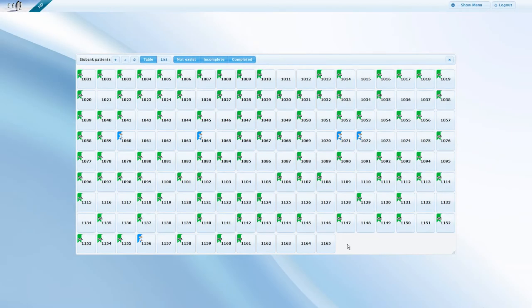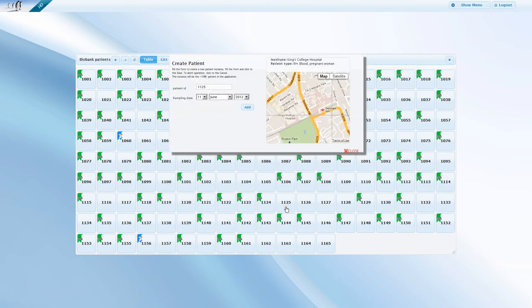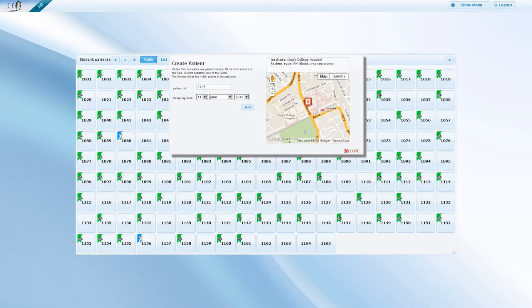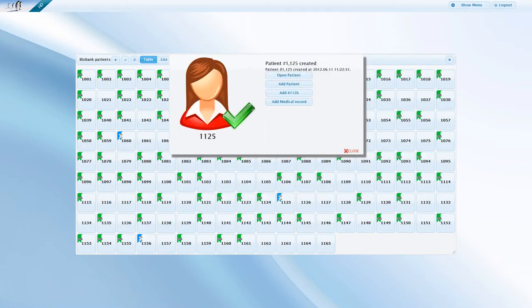To create a new patient, click on an empty slot. As slots have previously been assigned to the place where the sample had been taken, the map already shows this location. To create a new patient, click on Add. The patient now is successfully created.